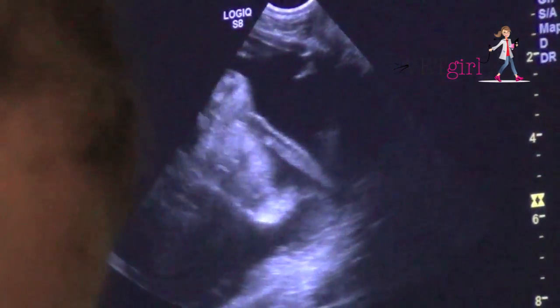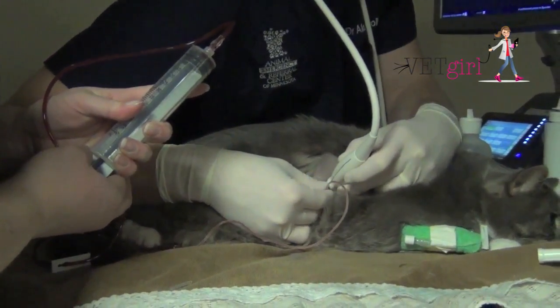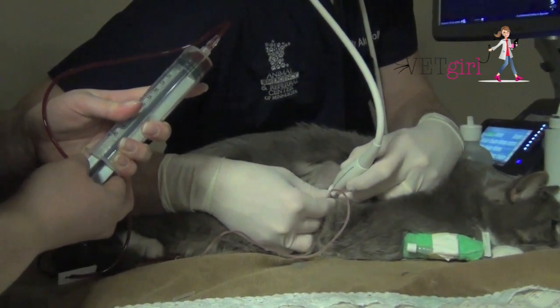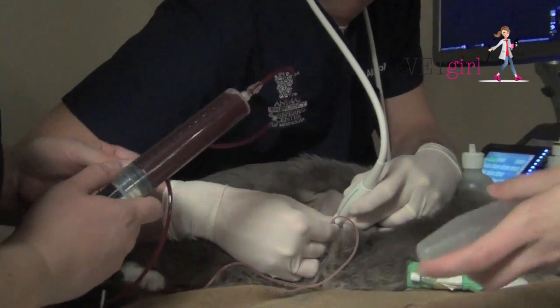If you don't have a FAST ultrasound, still go ahead and do a thoracocentesis — it can be life-saving in that dyspneic cat. Most of the time, we don't actually sedate cats for this because they seem to tolerate it relatively well.